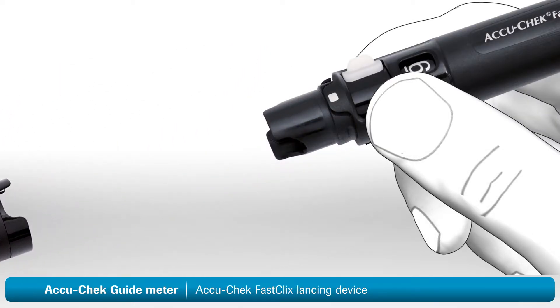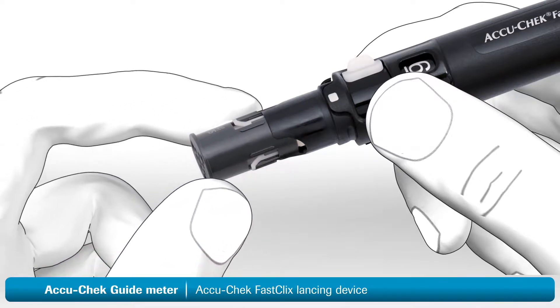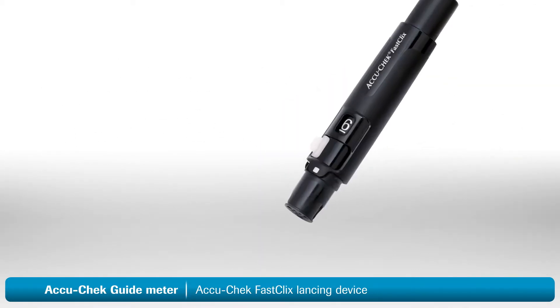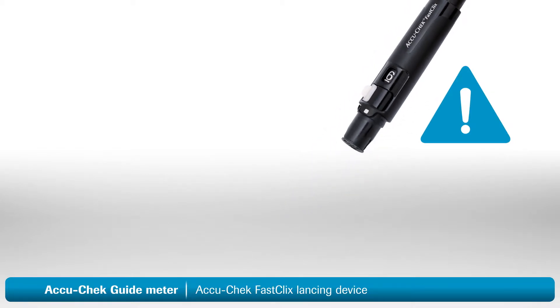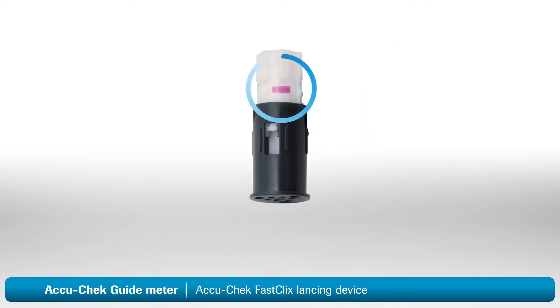Remove the cap from the lancing device. Now insert a new lancet drum, wide end first. Push it all the way in — it should fit snugly into place. This part is important: do not remove the drum until you've used all six lancets. Once you remove it, you cannot put it back in. A drum that has been removed will have a visible red line on the side as shown here.